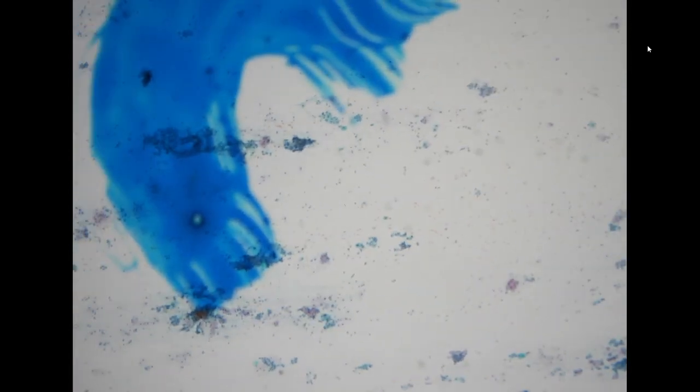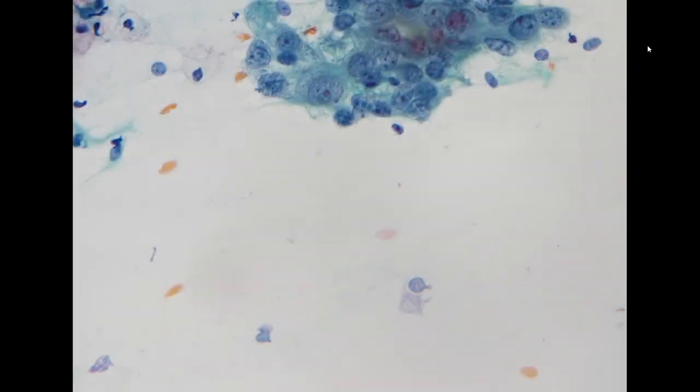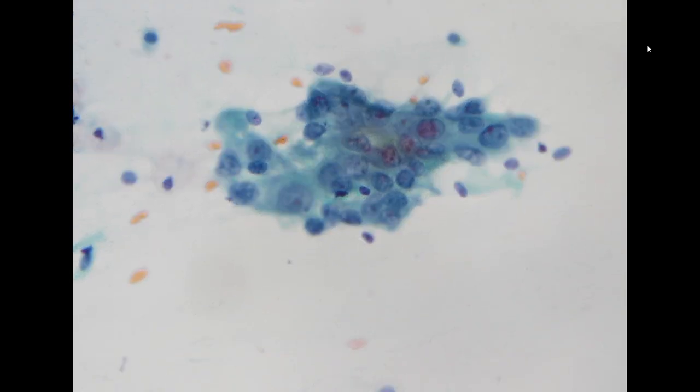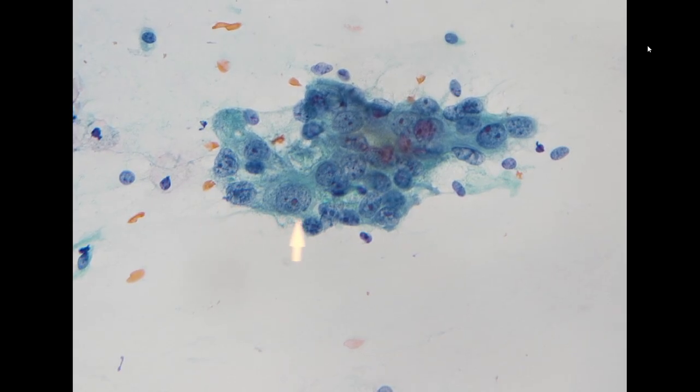Then we go around and we see a dot. We start to see a scattered, atypical cell cluster. The features look glandular. It is a little bit difficult to determine if these are repair or not.